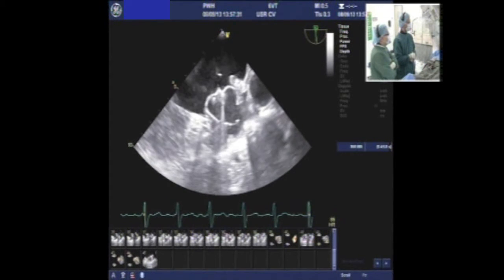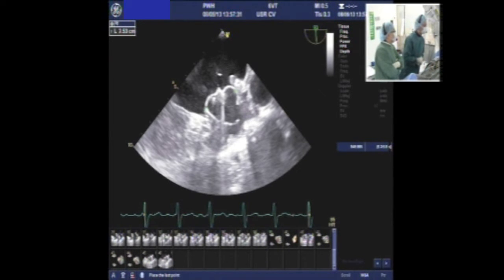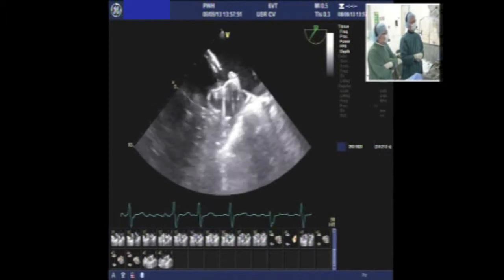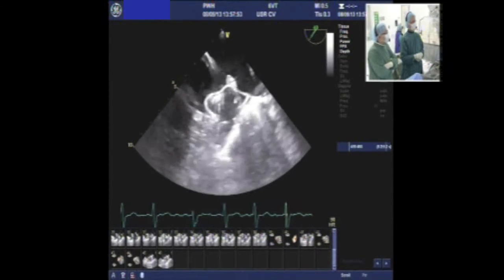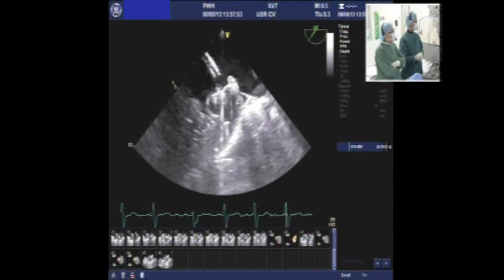From this view it is nice. It's always nice to look at 90 degree. How much is it? 25. 25, yes. So it looks like it's not compressed at all. Huh? No. Let's see the other views. Yep. This is 45 degree, compression is 25. So okay, there's still some compression.